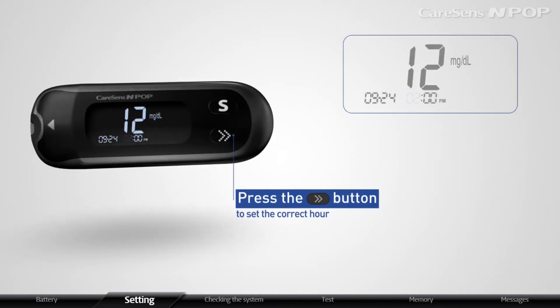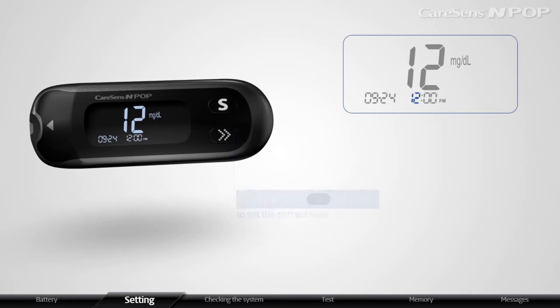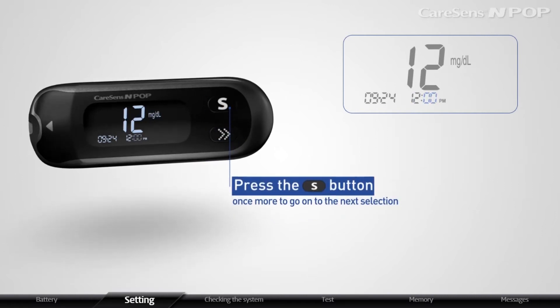Press the arrow button to set the correct hour. Then press the S button once more to go on to the next selection.